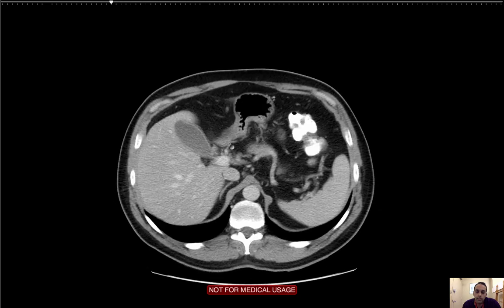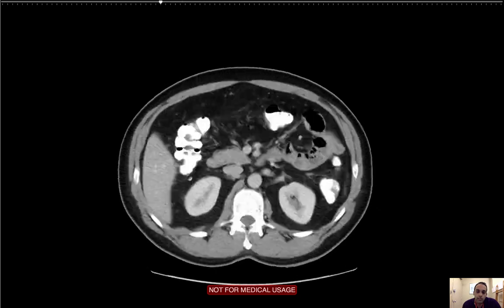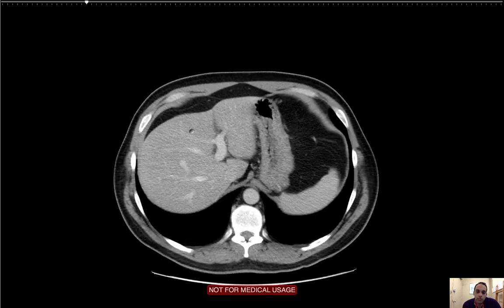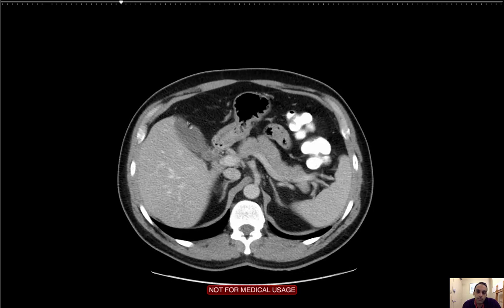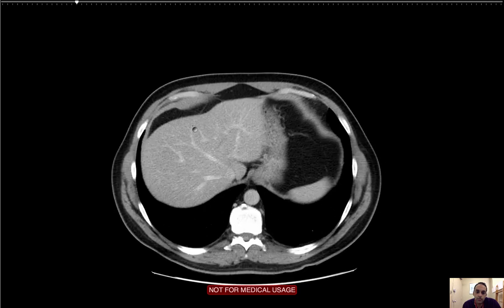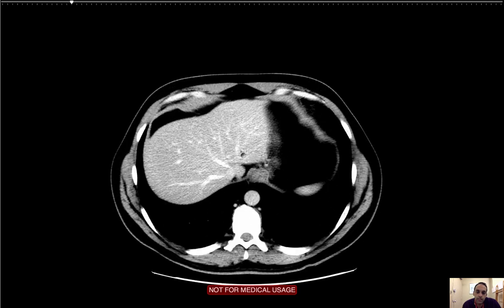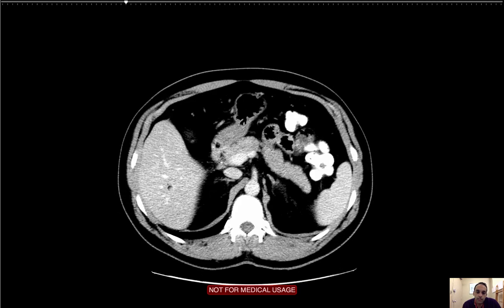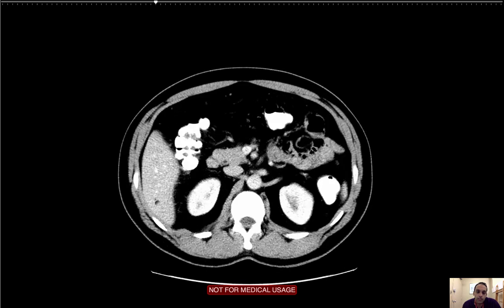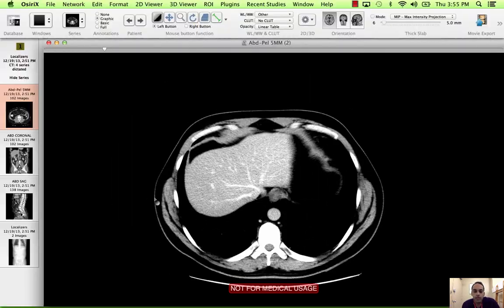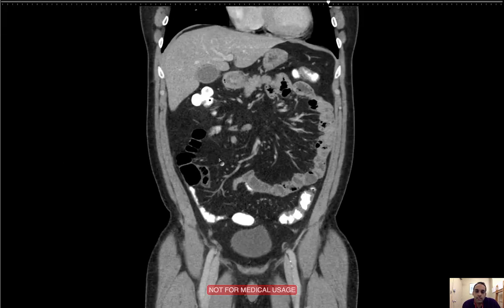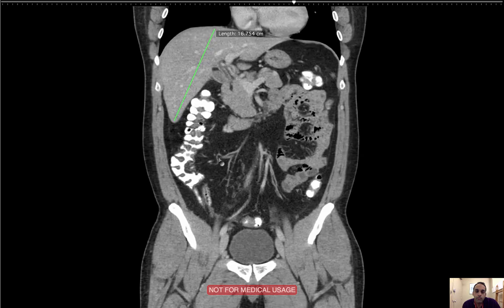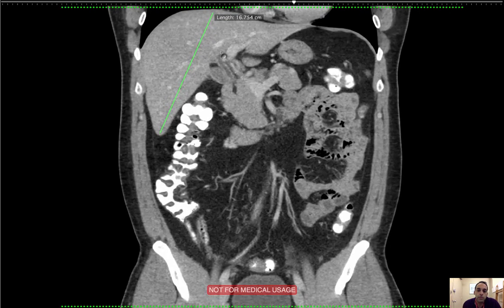Now I'm going down to the abdomen. The first thing I'm going to do is look at the liver. I'm looking for homogeneity, focal lesions, and the liver contour — is there any nodular contour like in cirrhosis? I'm not seeing anything. I'm going to narrow the windows, just looking at the left lobe and the right lobe, looking for any focal lesions like an abscess. I'm not seeing anything. I'm going to flip over to the coronal plane to look at the size of the liver — 16.7 cm, normal size, no evidence of hepatomegaly.